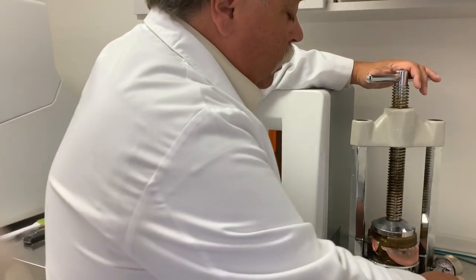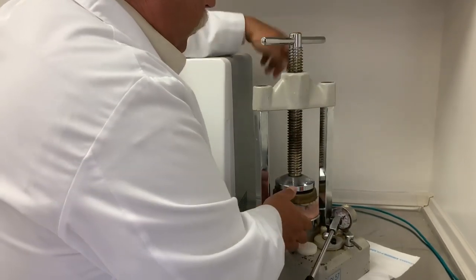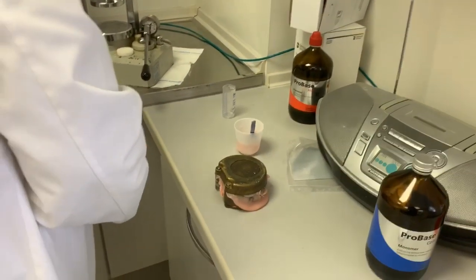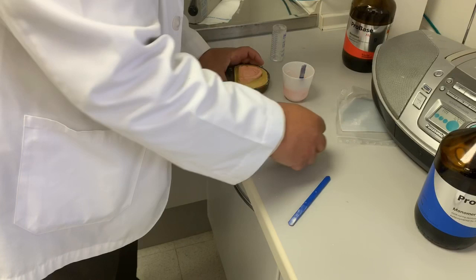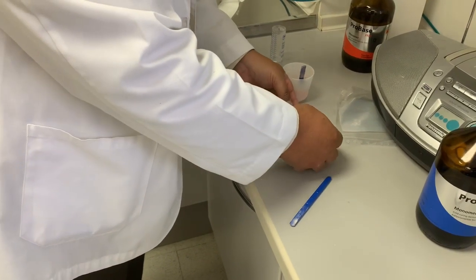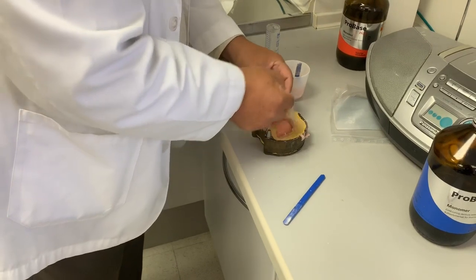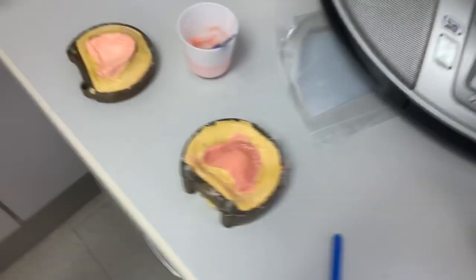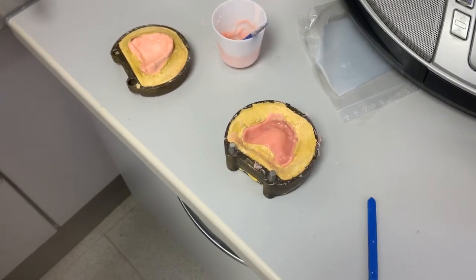Oh wow. So it's pretty stable now at 1,000 pounds of pressure. I'm going to release the press. And this is the start of our denture. That's neat. So the teeth just stick right to it when it dries. This will bond around the teeth and will become one. That's amazing. Well, thank you, John. You're welcome.